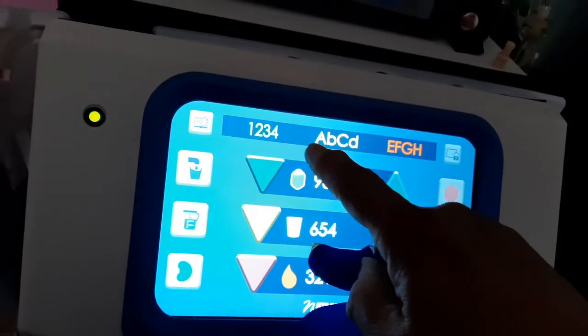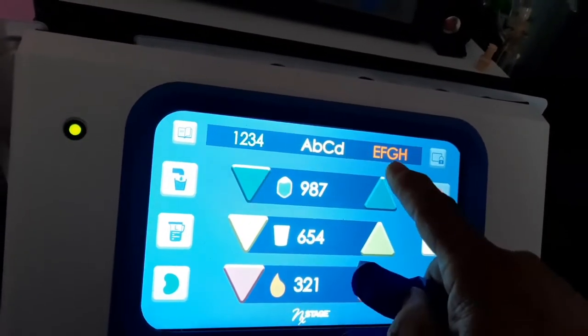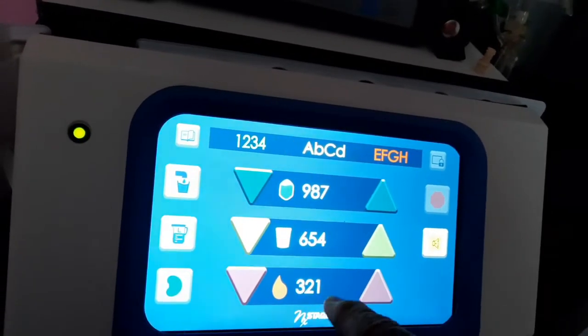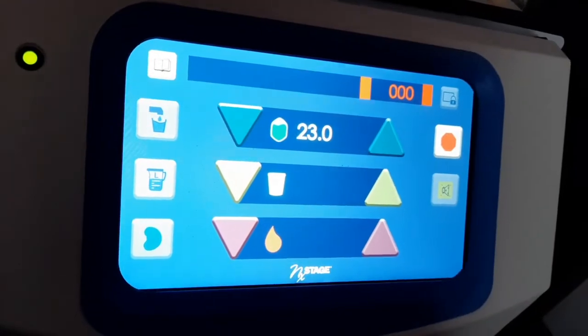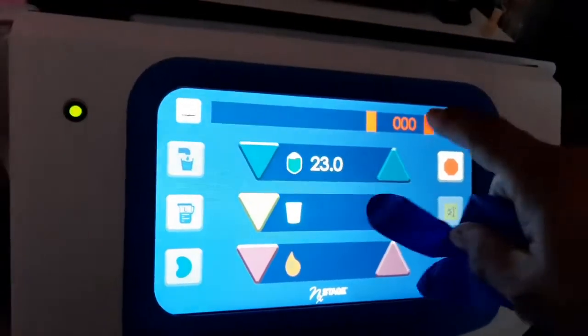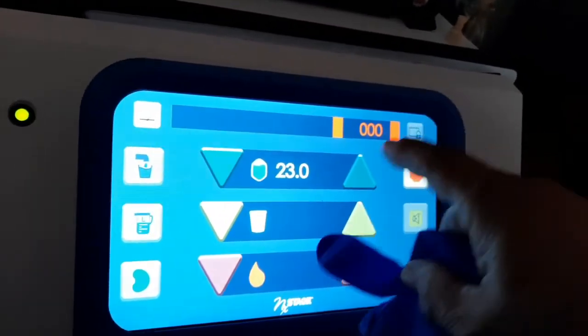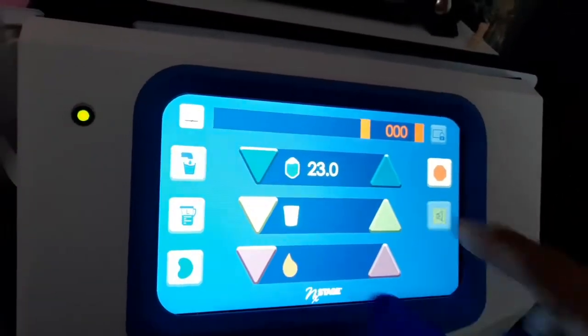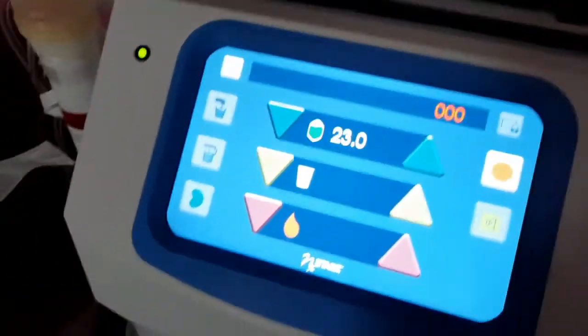You'll get 1, 2, 3, 4, A, B, C, D, E, F, G, H, yeah. 987-654-321, that's correct. Hit mute again to let it know that you've seen it. And now you'll get the triple zeros on the right red alarm area. And you'll get the 23, which is what it has primed up to.